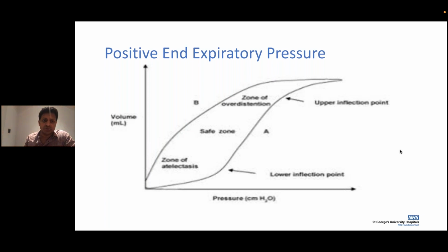So you do want to prevent atelectasis. It's like a balloon with a little bit of air is always easy to blow into. And if you over distend, you're not going to have good gas exchange. And if it's completely deflated, then you're likely to have what you call atelectasis, causing more shearing forces, causing more ongoing damage. So it's important that we try and maintain your ventilation in your safe zone. And I'll talk a bit more about safe zone in the next slides.